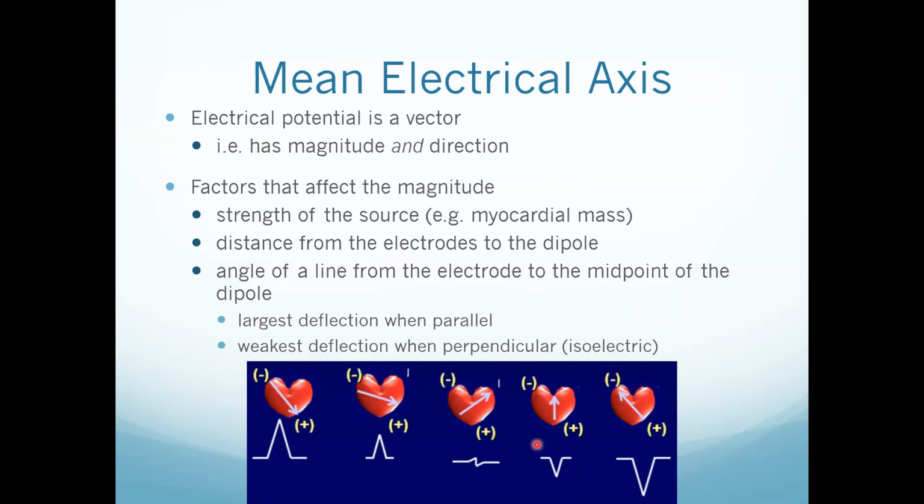But another contributing factor to that is going to be the size of the chamber itself and the amount of blood within it, because it acts kind of to increase capacitance. So if you have eccentric dilation of a ventricle, that's going to give you a stronger signal, just the same way that concentric hypertrophy would.